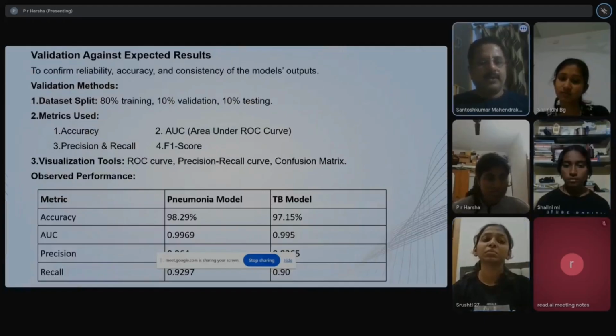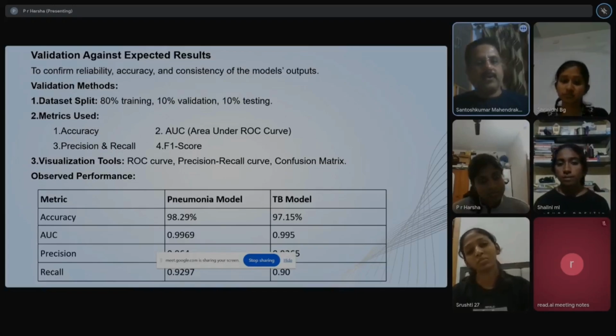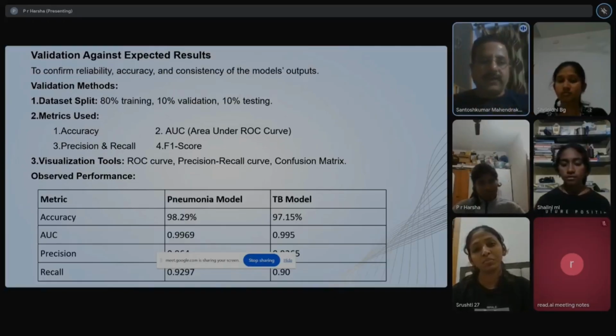Okay. Now the question is to Shalini. Shalini, can you explain what is AUC? And in your output, you are talking about confidence. And here, nowhere you are talking about the confidence. How are you relating the output of these parameters and your output as a confidence?